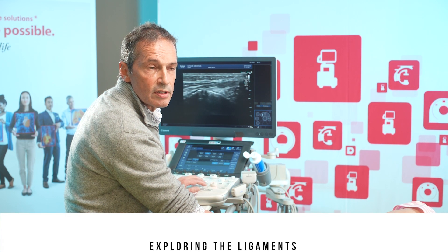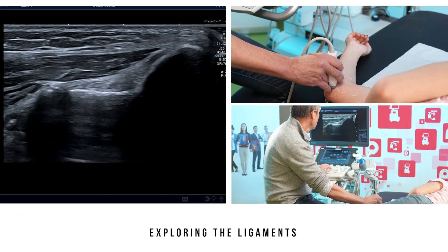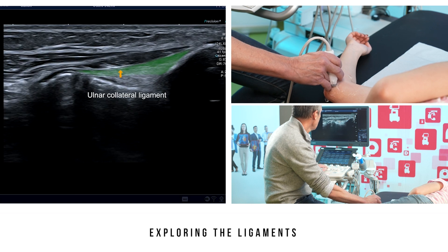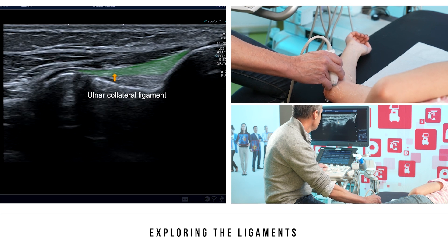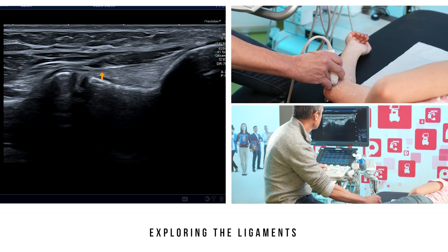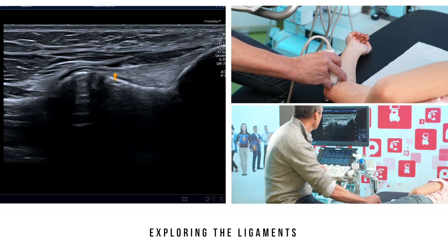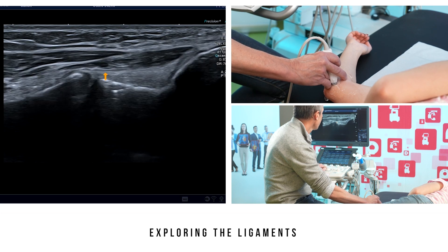After completing the tendon analysis in the axial plane, we ask the patient to stay in the same position with elbow flexed and supination. We find the medial epicondyle again and go down a bit. The anterior bundle of the ulnar collateral ligament appears. This ligament has two distinct bands. The anterior band ensures elbow stability between about 30 degrees and 120 degrees flexion. If we tip the probe slightly, the longer posterior band appears, responsible for elbow stability when flexion exceeds 120 or 130 degrees.